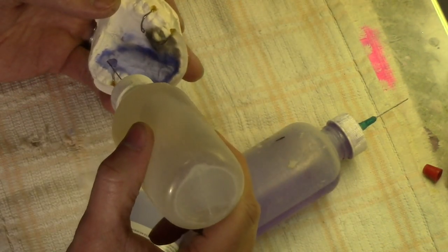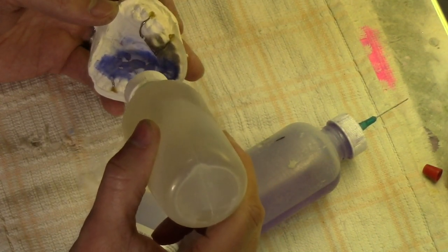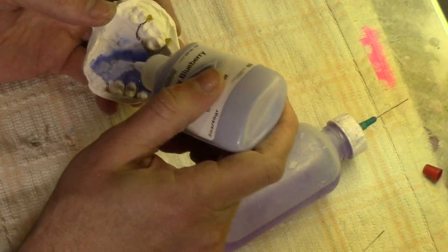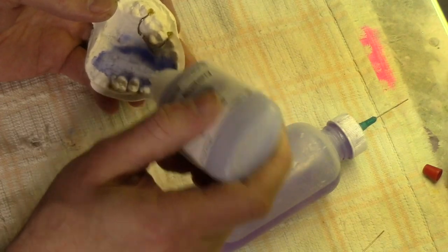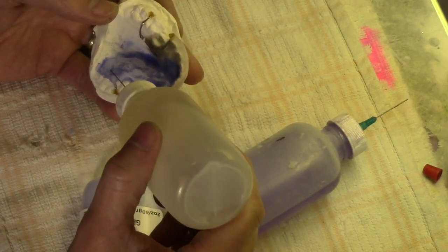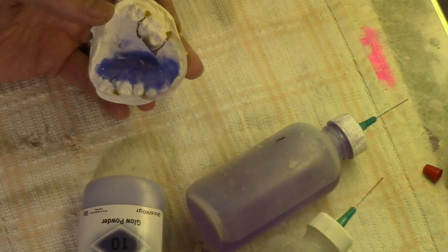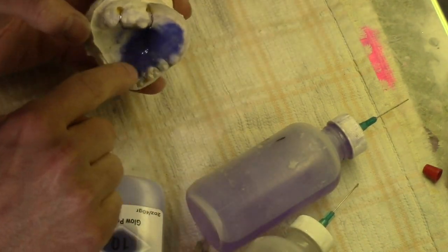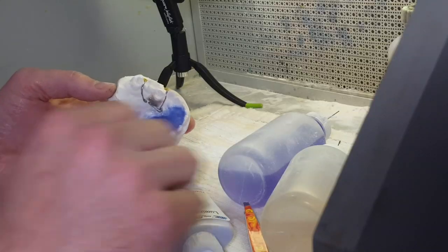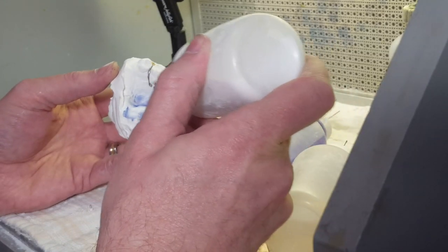I tend to sprinkle in sections — I'll do one half, then switch to the other half, and just tie them in together. I still didn't get it as homogeneous as I want, so I'm going to put a clear coat on top.